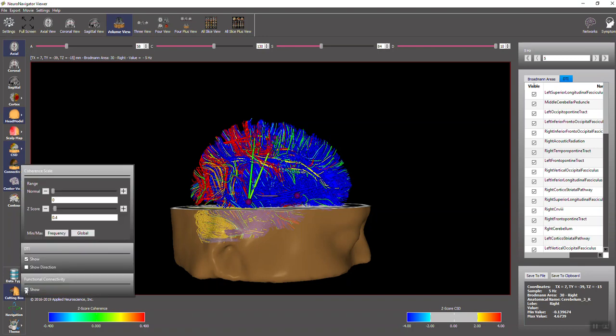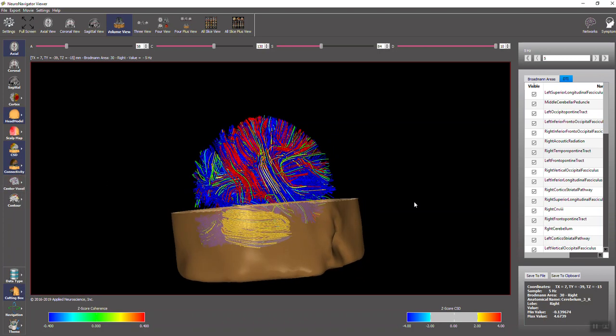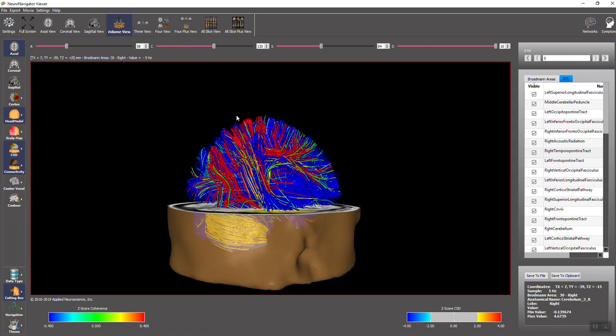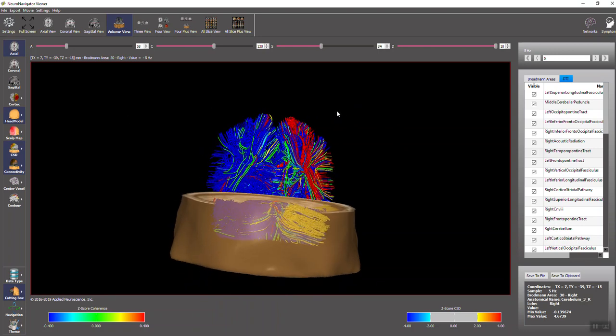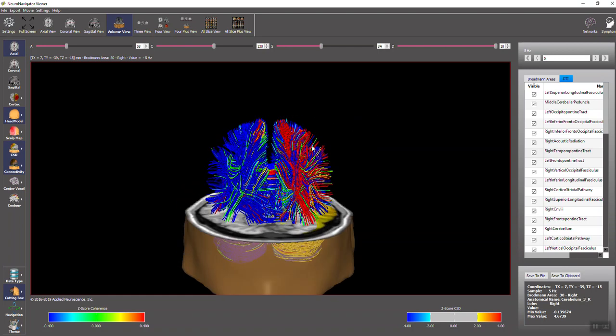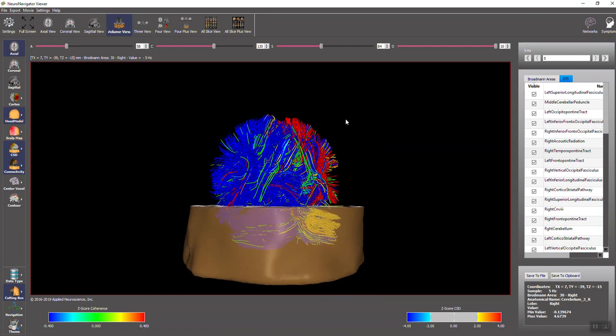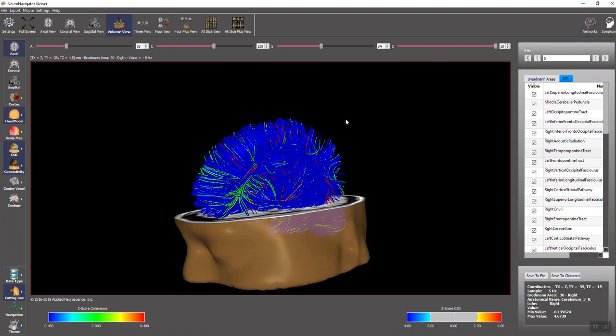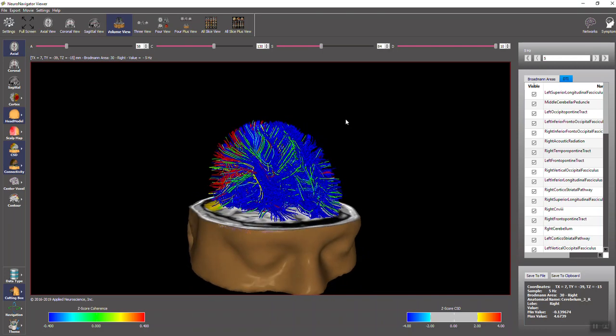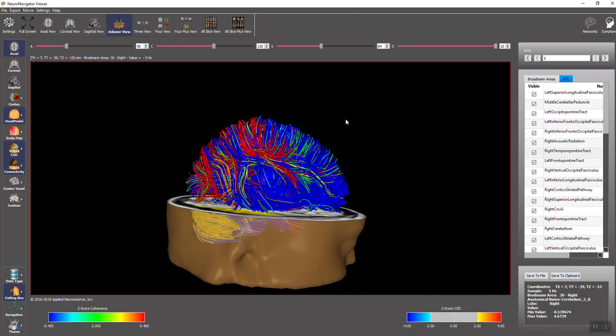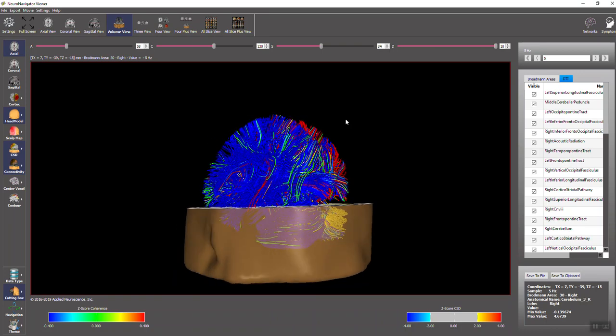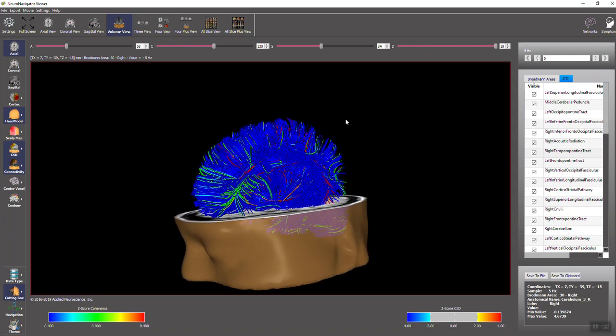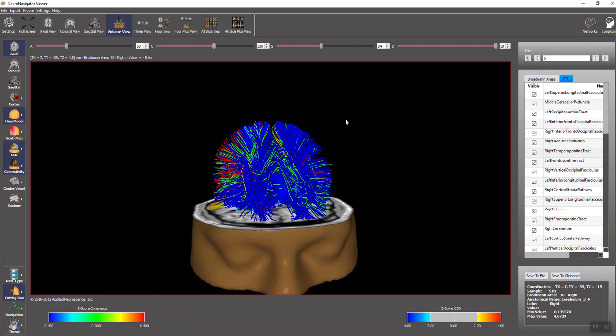So I'm going to get rid of the center voxels and just have the diffusion tensor imaging here and the coherence values which you can see are deviant from normal in the right parietal region where this person was injured as well as the cerebellum. Here's his left hemisphere and his right hemisphere. So this is a quick view of the navigator that includes diffusion tensor imaging and all of the fiber bundles now as opposed to just the 12 that we had in the past.